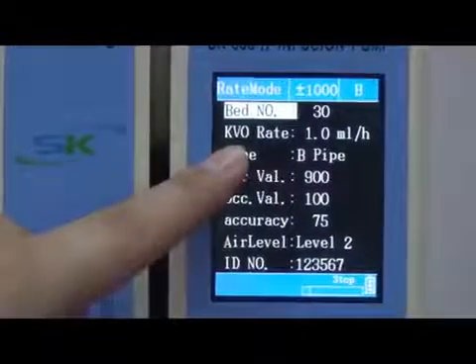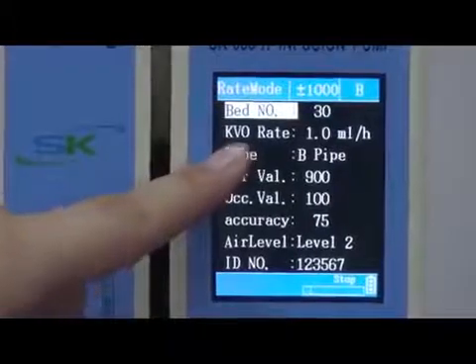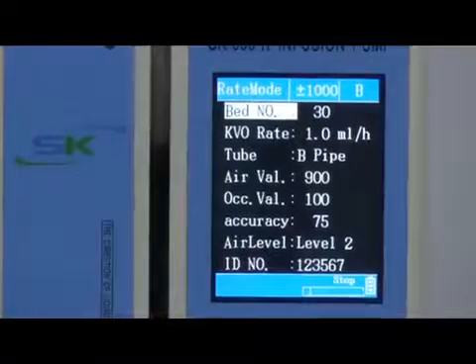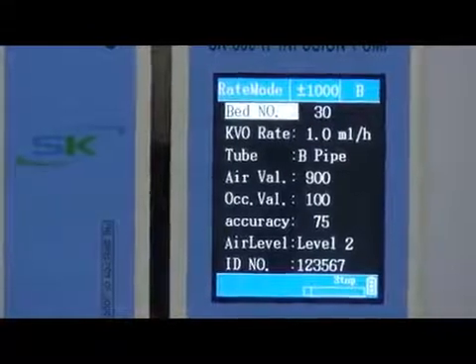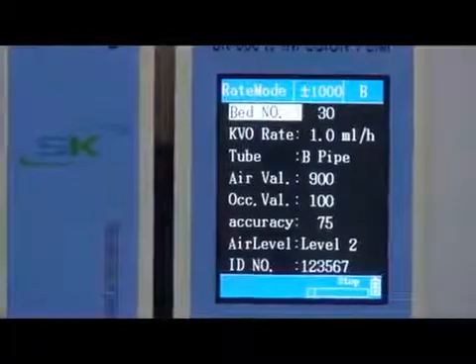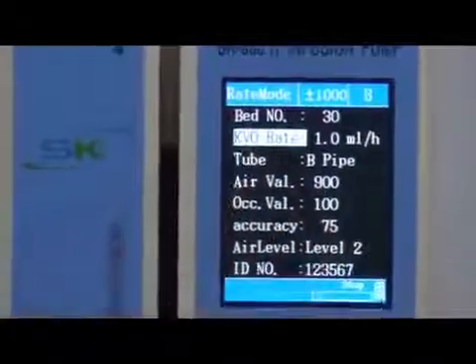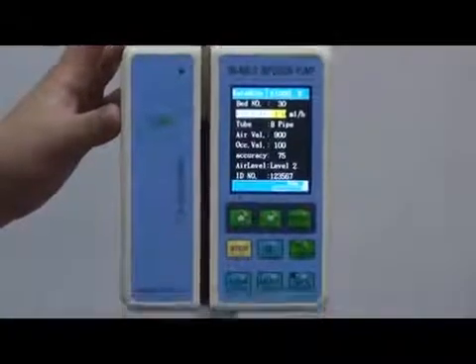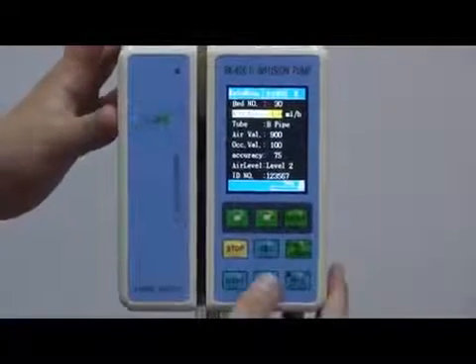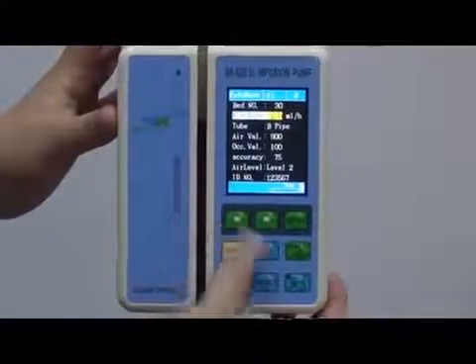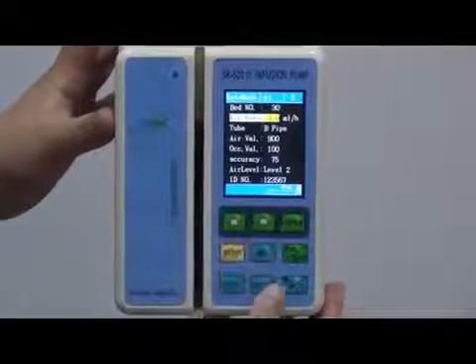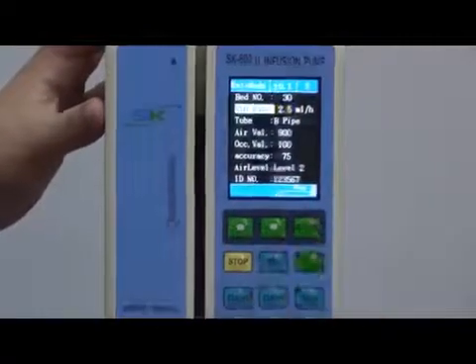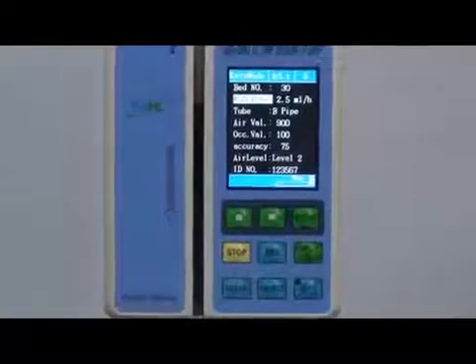Next is the KVO rate. KVO means keep vein open. This value can be changed from 1 to 5.0ml per hour. Press enter key and let's change it to 5.0. Press enter key again. This is the KVO rate.